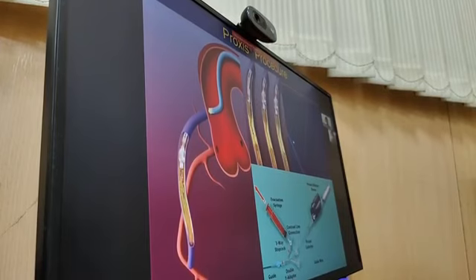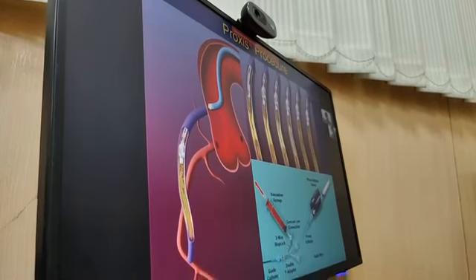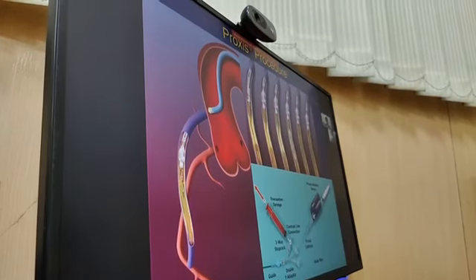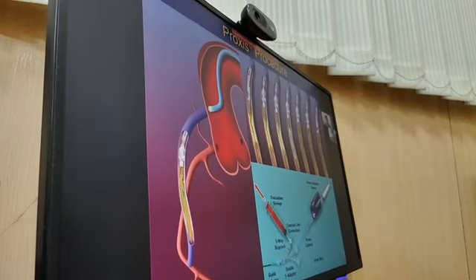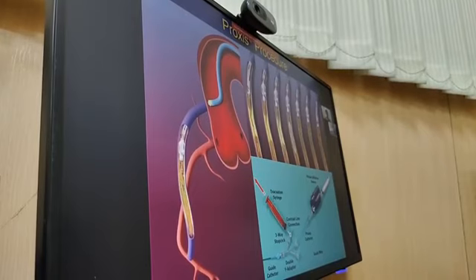So you put this device here, you put a stent, and then when you remove it, because it has stopped blood flow completely, there is no embolization. Before you deflate your balloon, you take a catheter and suck out everything which is there. It is another catheter, which is inbuilt and comes with the whole device as part of the system. You suck out the whole thing so that there is no embolization.